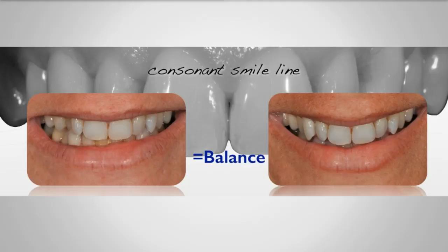How is it going to solve the problem of very thin alveolar bone facially? I mean, this technique is not going to solve that problem. If you have thin facial bone, you've either got to stay away from it, or if it's deficient, that area is going to have to be grafted to get the contours first, either at the time of surgery or before the implant is placed. Where exactly is the Teflon tape placed?